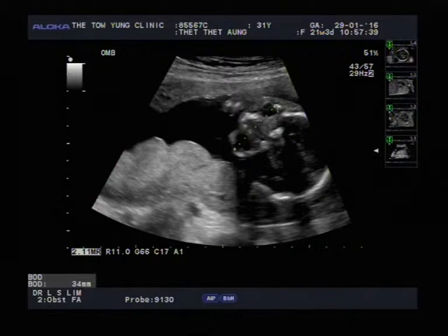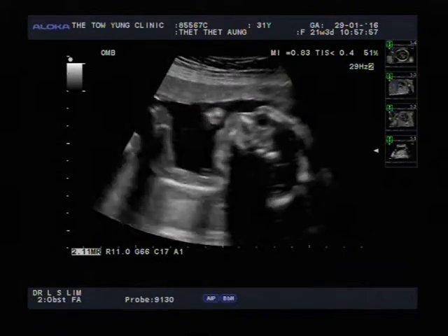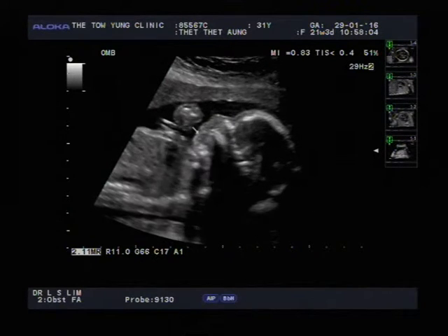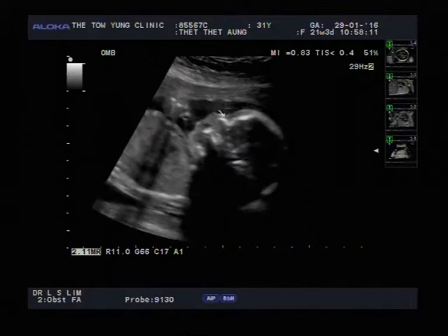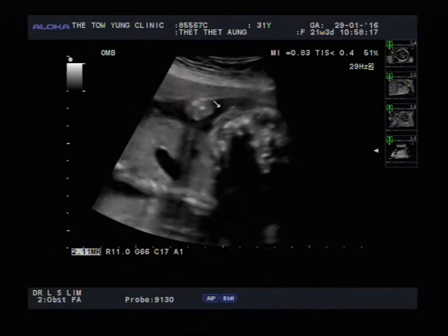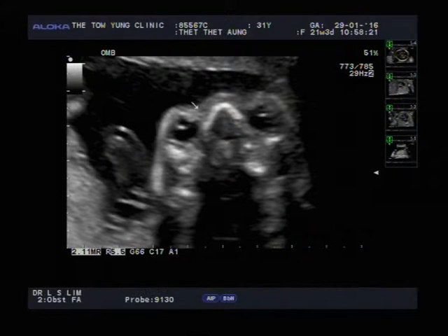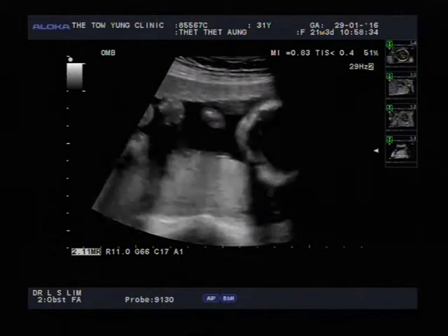The binocular distance is 34 millimeters — that's the distance between the two orbits. The baby's nose is here, and the baby is looking at my arrow. Let's see whether I can do the face profile. The nose is there — the forehead is here. Inside the orbits you can see the lens of the eyeball — there's the lens on one side and over here the other lens. So we know the baby has eyeballs. Let's go back to the face profile.